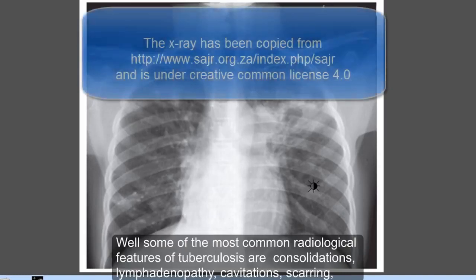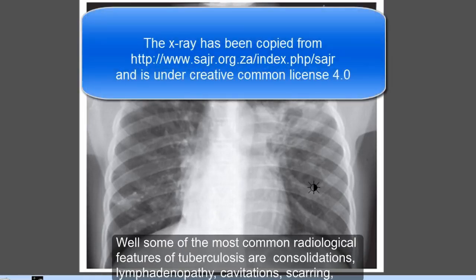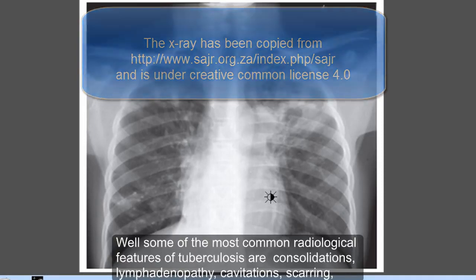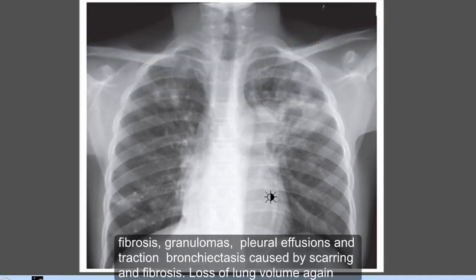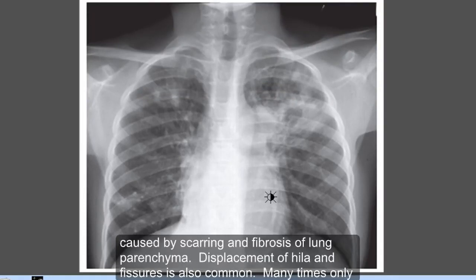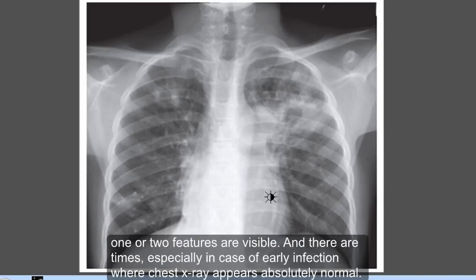Some of the most common radiological features of tuberculosis are consolidations, lymphadenopathy, cavitations, scarring, fibrosis, granulomas, pleural effusions, traction bronchiectasis caused by scarring and fibrosis, loss of lung volume again caused by scarring and fibrosis of lung parenchyma, and displacement of hila and fissures.